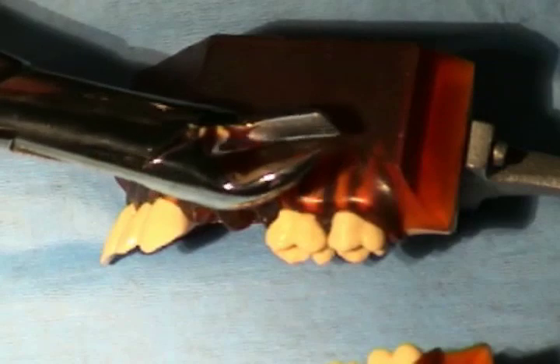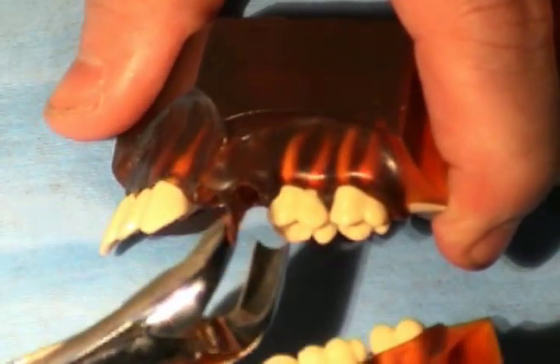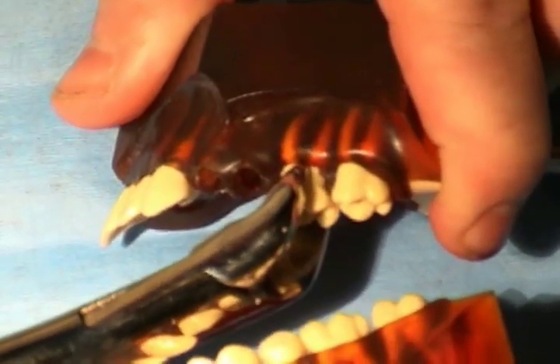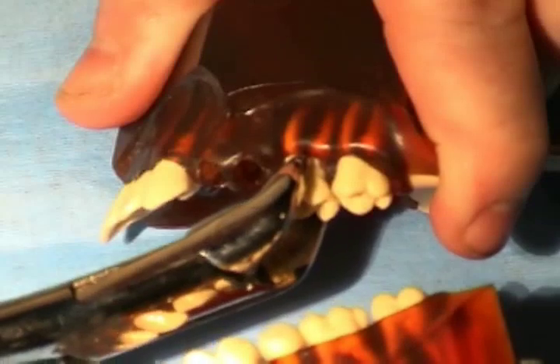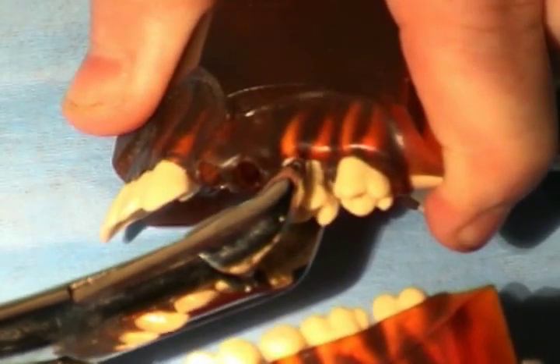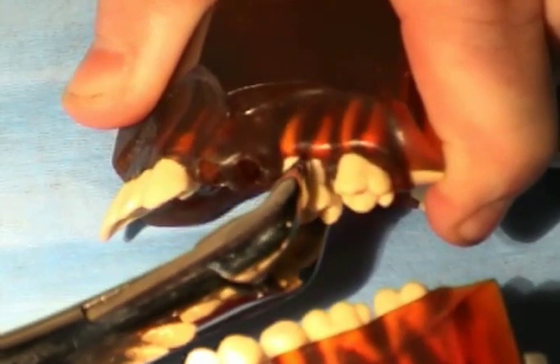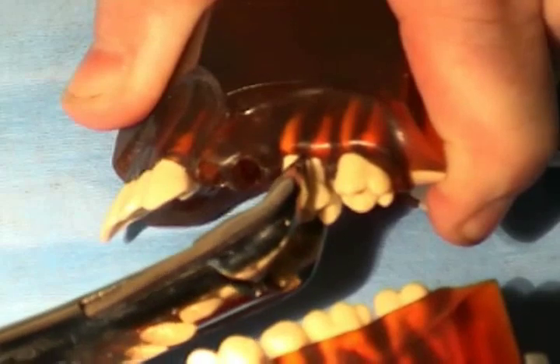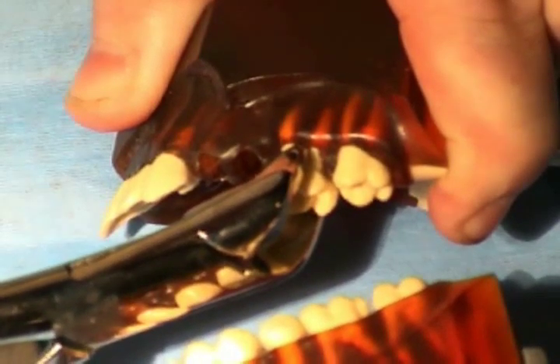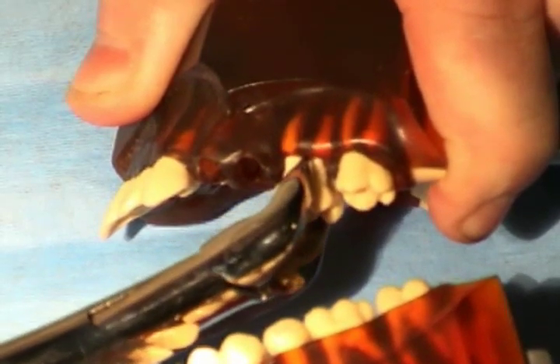For extractions of molars, a cowhorn forceps can be used. The upper cowhorn comes in a right and left because the buccal part of the forceps is pointed to engage the tooth into the bifurcation. This is especially useful when the crown is destroyed. The upper cowhorns are numbered 53R and 53L. Other instrument manufacturers will have the same forceps called 89 and 90 for right and left respectively.